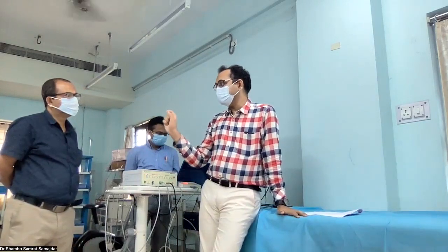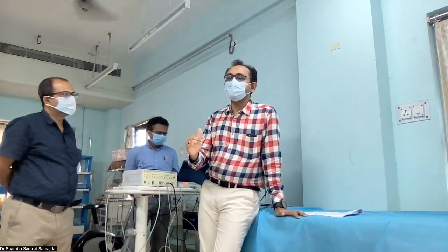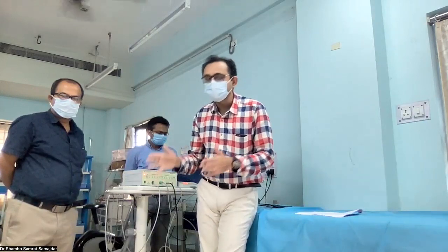Again, we need to understand that with age, this E by I ratio changes. So there is a specific note in our reporting format also: what is the normal E by I ratio for a specific age group? So this we need to calculate. The E by I ratio gives us information about the functional status of the parasympathetic nervous system. So these two tests are generally used to detect any parasympathetic nervous system abnormality. Next part is sympathetic nervous system activity. Again, to test the sympathetic nervous system, we have two tests.